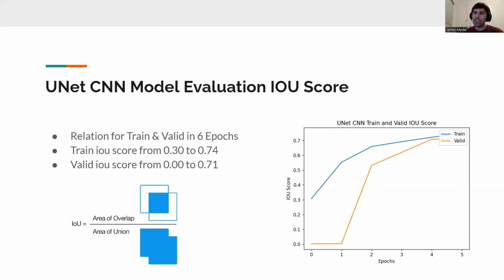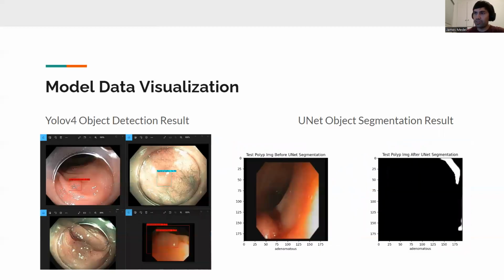And how we can tell if we have a model that's great at detecting or segmenting images is if this value is above 0.5. And what that'll look like in the case of the images here, the boxes will be closer to intersecting. So they'll be closer together the higher the IOU score. And we can see the IOU scores increasing in our graph.